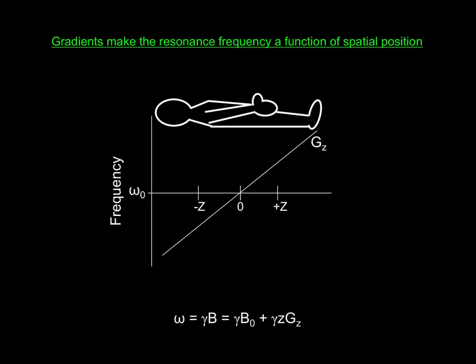So to describe how the diffusion preparation works, we're going to recall from those basic MRI lectures that occurred way early in the summer, that when you first put an object, here I've got this body laying down in the scanner in the bore of the magnet, the water molecules are resonating at the Larmor frequency. So here we're calling that omega 0. And when we turn on a gradient, the precession frequency is dependent on the position.